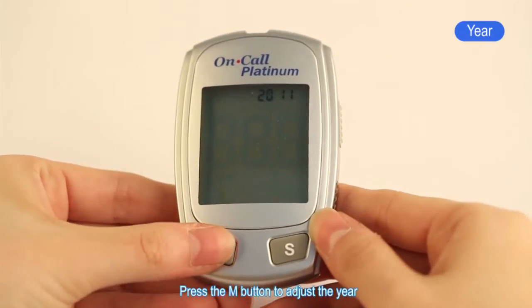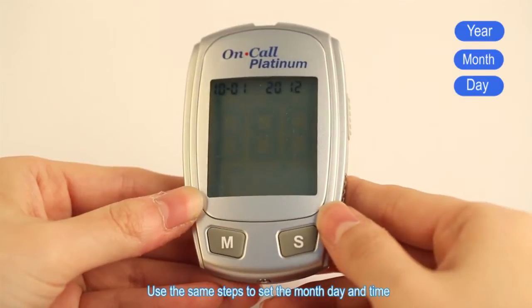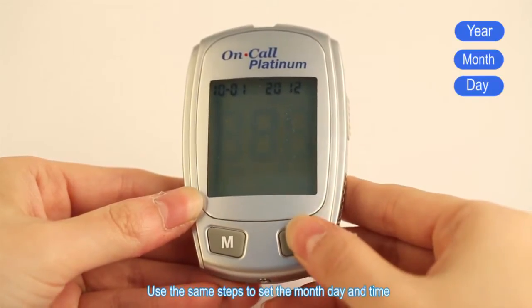Press the M button to adjust the year and then press the S button to save your choice. Use the same steps to set the month, day, and time.